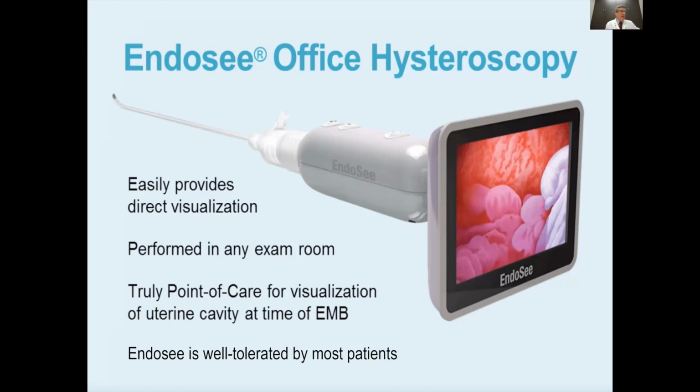Now, the advantage to that is, as I said, it's less uncomfortable, it's brief, and it's comprehensive. We have the ability to identify areas that may need biopsy if necessary, so we can get a definitive diagnosis. The patient's awake during the procedure, and it affords us the opportunity, once we're done, to sit and talk with a patient right then and there, know what we're dealing with, and come up with a plan moving forward to how we're going to address the cause of her abnormal uterine bleeding.